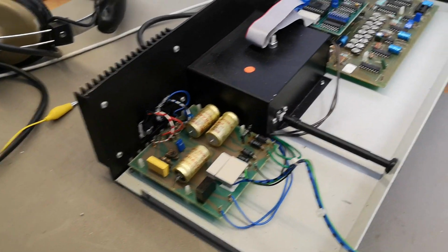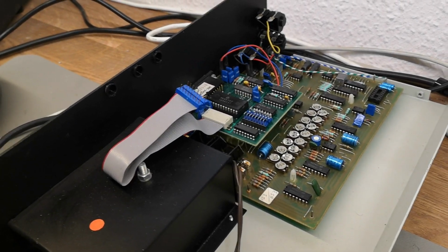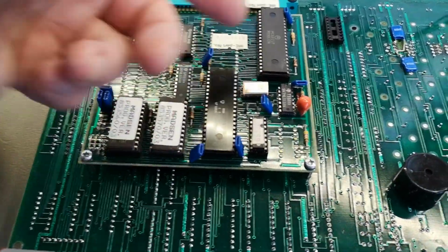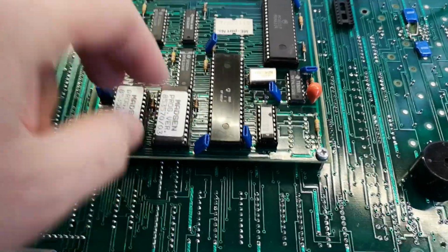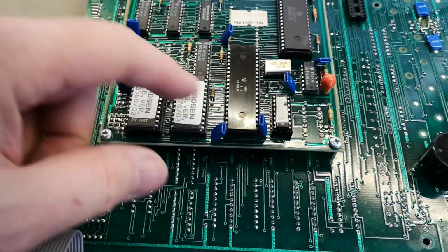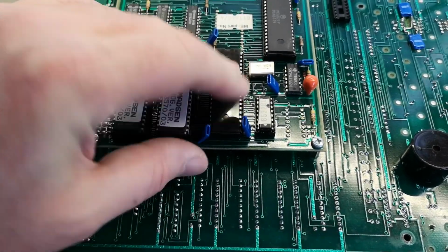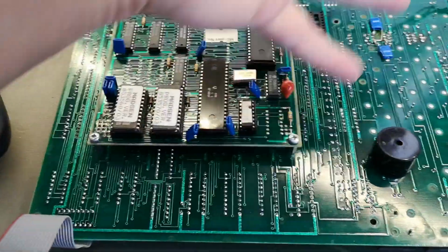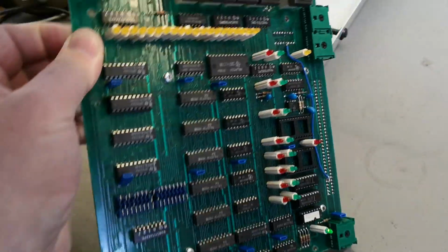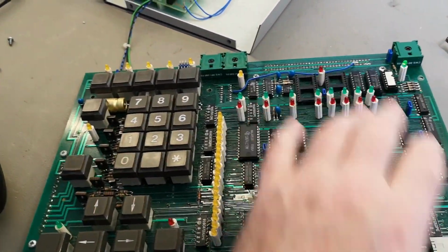So yeah, I think I'm gonna throw this back to the shed because that was no fun, and I can't really continue because everything is alive. It just don't work, and I don't have schematics. I don't have the software. Anybody would just go and replace the EPROMs or some of the programmables. But yeah, it scans everything. It's just not responding. Damn it. So, but it could have been so much fun to play with this. I really wanted to play and see, you know, who can hear the best. That could have been so much fun.